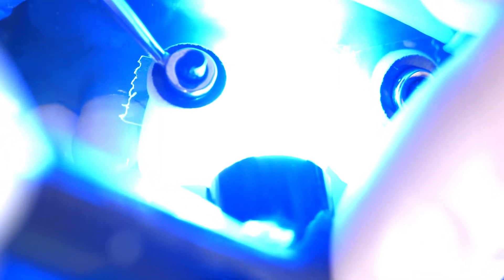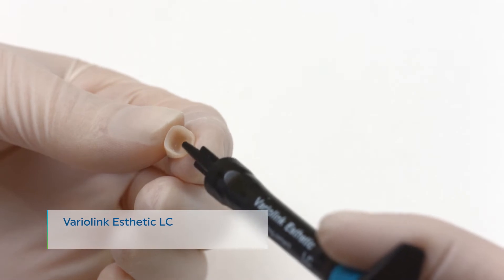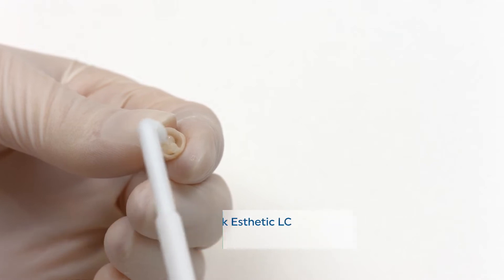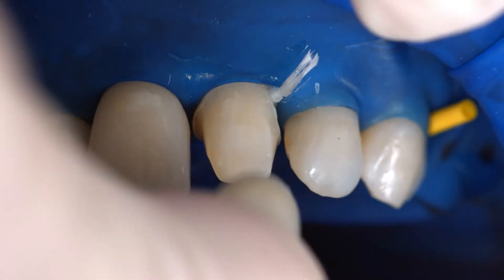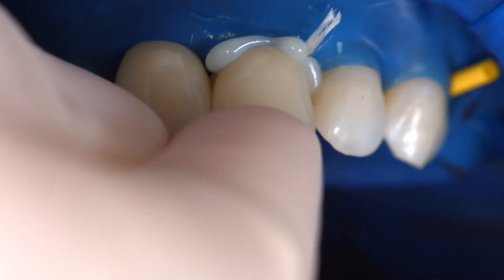For example, blue phase style. Apply the desired amount of Variolink Aesthetic LC directly from the syringe onto the restoration. Seat the restoration and retain it in place exerting uniform pressure.